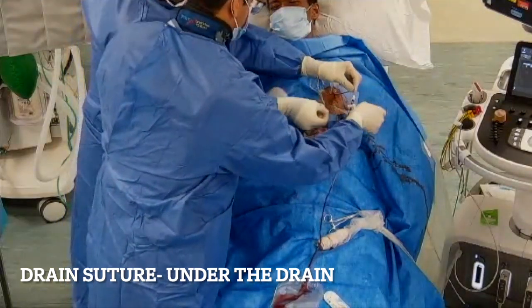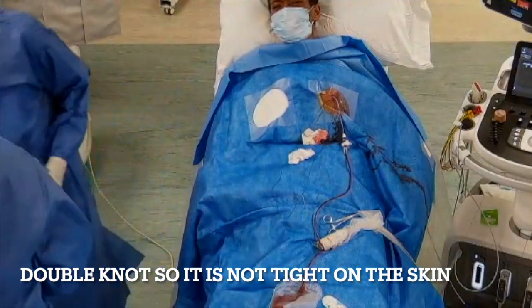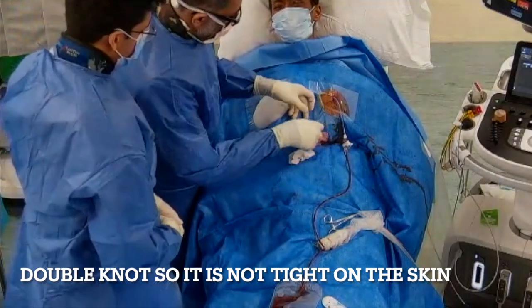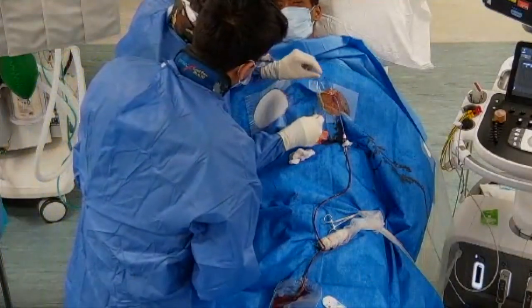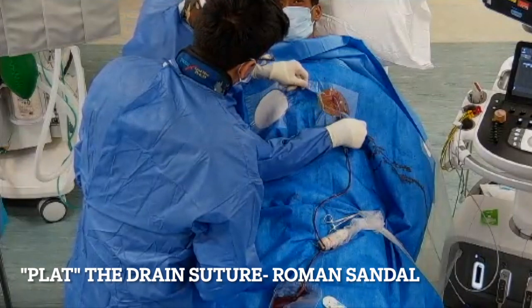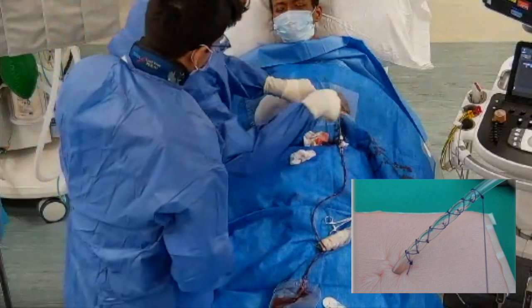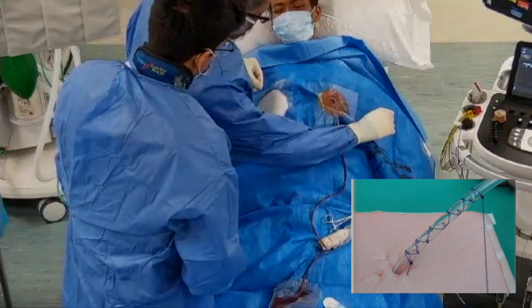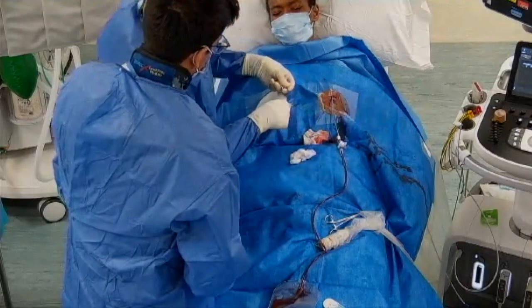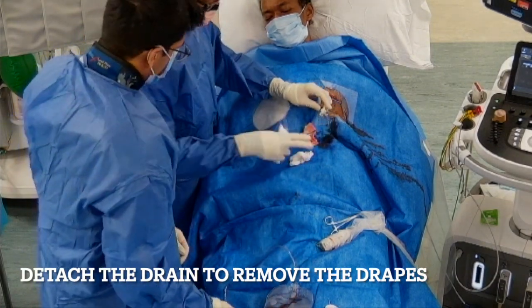We do a double knot and draw it down towards the skin, then perform a Roman sandal technique on the drain — going under and over, under and over — tying double knots at each step to secure the drain firmly in position without requiring the needle any further.